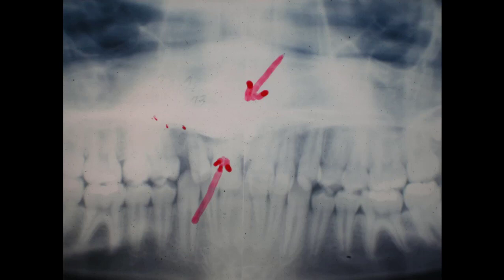Now this is a panorex, and I'm looking at it as if I were inside the mouth looking out. So this is the left hand side of his mouth. The cuspid is laying right in here, and it comes over and it's just rested right on the central tooth. It's eaten about 2/3 or more of the root. I'm going to show you a lot better x-ray of it, but this was a starting x-ray of this young man.